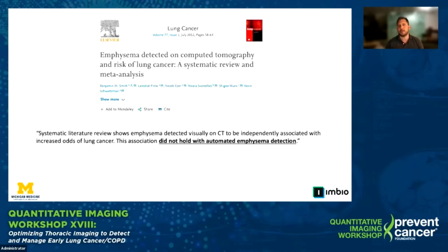So we had originally designed the report to include a personalized cancer risk assessment based on lung density measurements, gender, and age, but initial results did not reveal a strong association between quantitative lung density and lung cancer. We looked at the literature and found a meta-analysis that concluded that there was no significant relationship between lung density and lung cancer, even though it found a strong association between visually detected emphysema and lung cancer. This was a very surprising result.